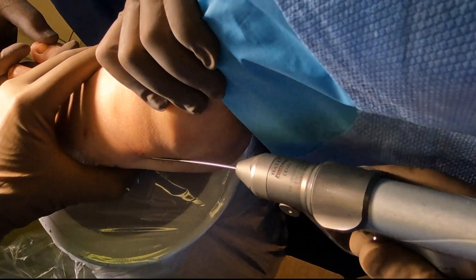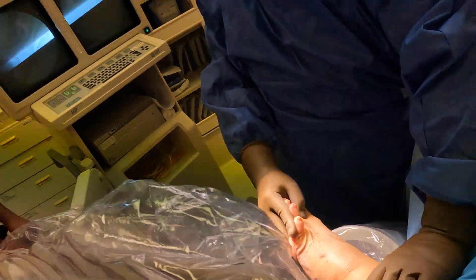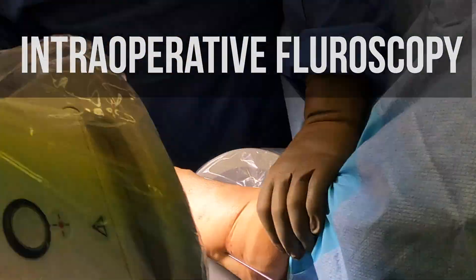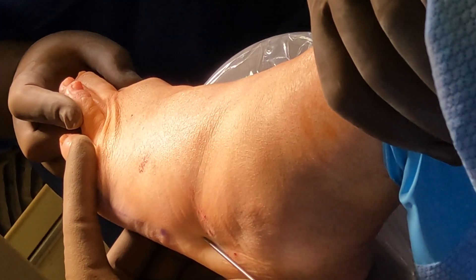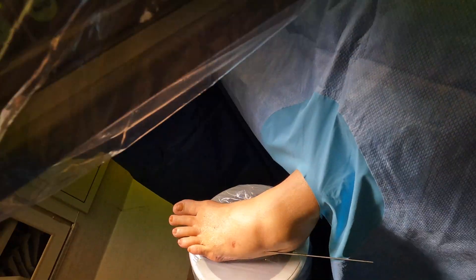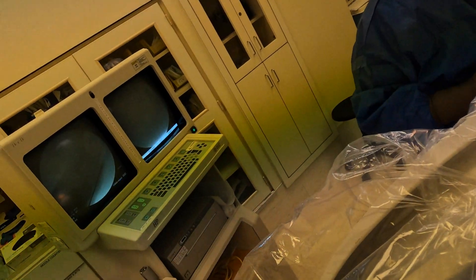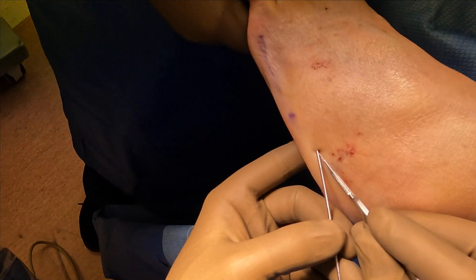You can see we're inserting a guide wire down the metatarsal shaft, which allows us to place the screw in a proper position. We're using intraoperative fluoroscopy — that's x-ray — to make sure we have perfect placement. We're tapping the wire in to help it find the medullary canal and make sure we're not going through the cortical bone, but getting it right down the canal.